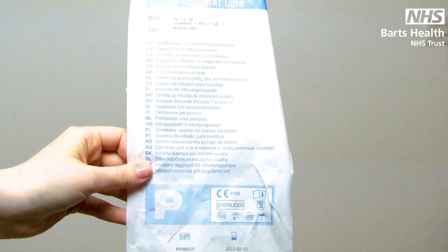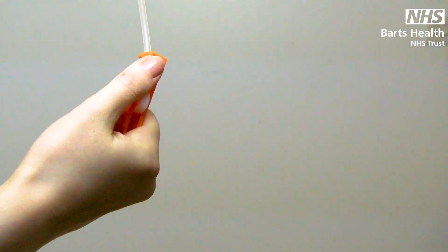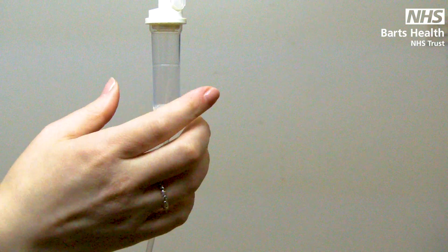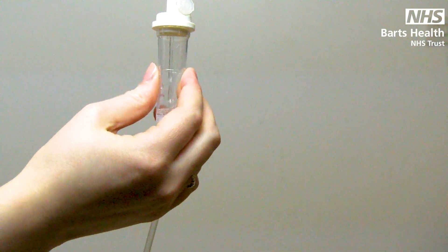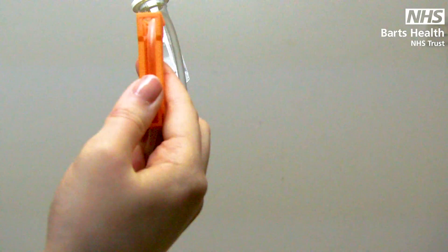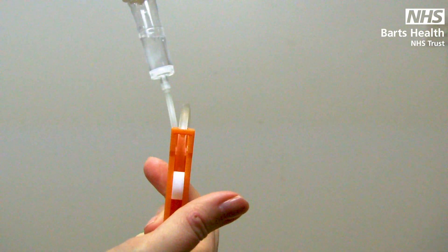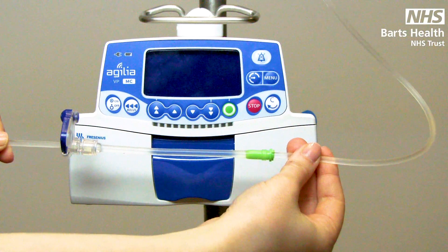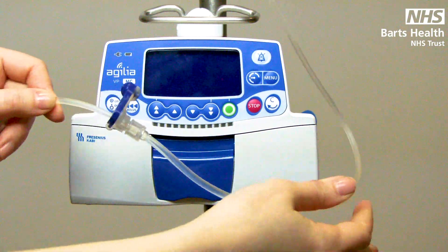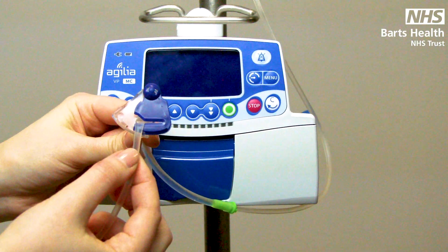This is your standard giving set. Remember to roll down the orange roller clamp, spike your bag, and fill the chamber to the line indicated. Then you can release the orange roller clamp and slowly prime your line. Further down the line you will find green and blue colour coding.